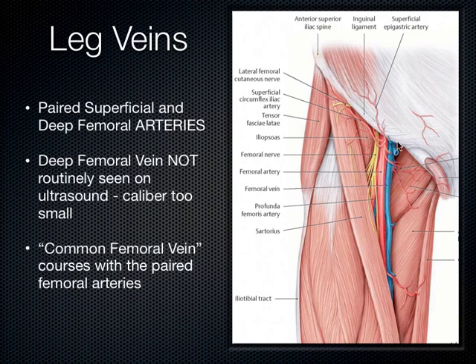The way I remember that the vein is more medial than the artery is the rhyme: venous rhymes with penis. Good, venous penis. Someone, you heard that one already. So you could say venous vagina if you wanted to too. But that's because sometimes people say other things. I think that's just easy to remember, kind of rhymes: the most medial structure would be the vein.